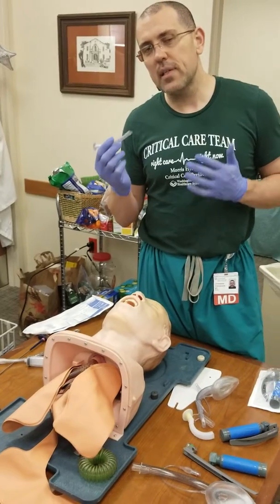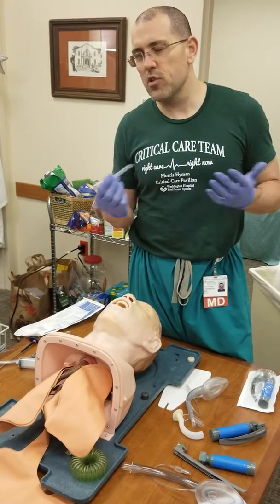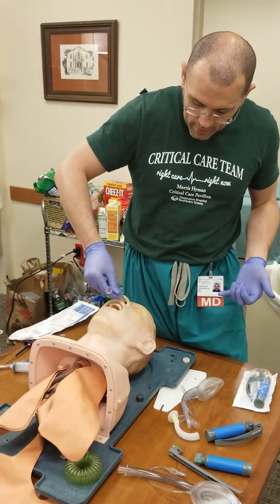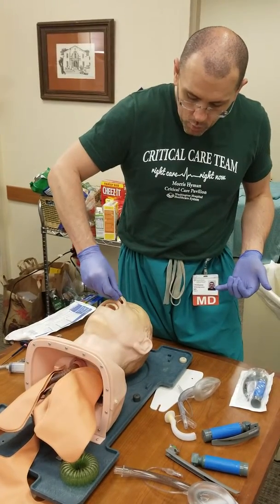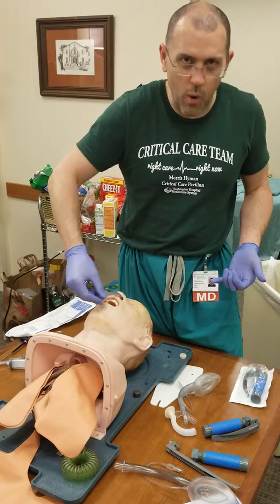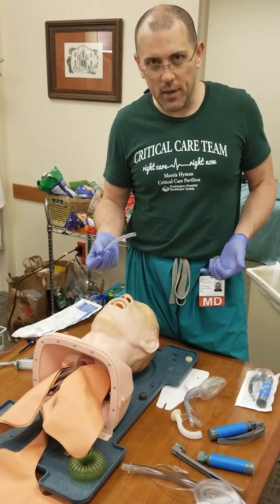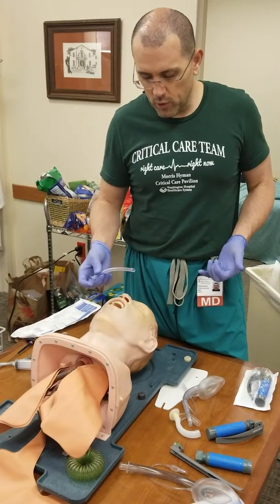Now a commonly seen mistake with the nasal trumpet is that because people think the air comes up, they think they need to angle it upward to get it in. You don't go up — you're not putting in a VP shunt into one of the ventricles of the brain.